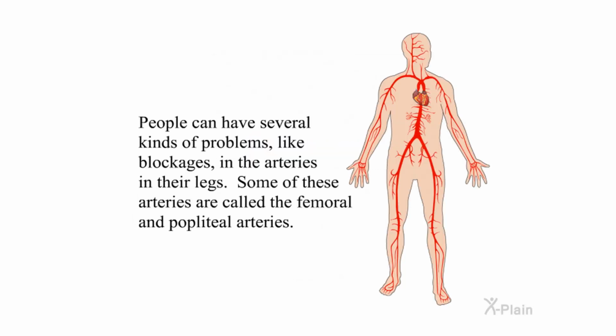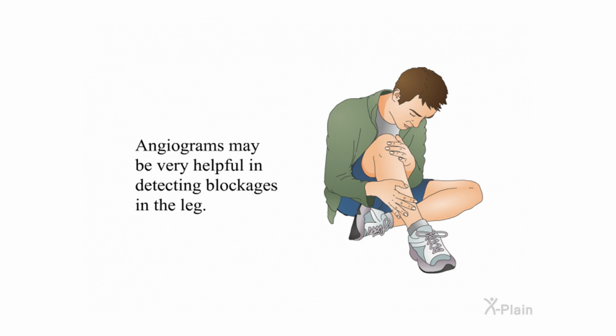Summary. People can have several kinds of problems, like blockages in the arteries in their legs. Some of these arteries are called the femoral and popliteal arteries. Angiograms may be very helpful in detecting blockages in the leg.